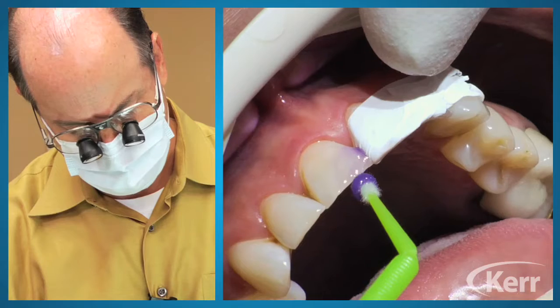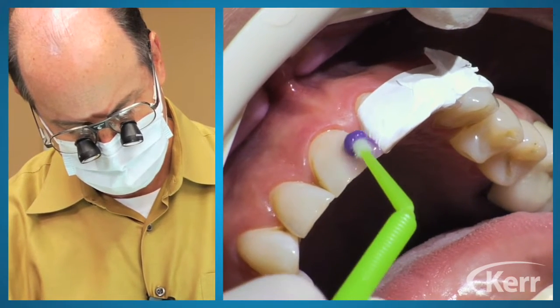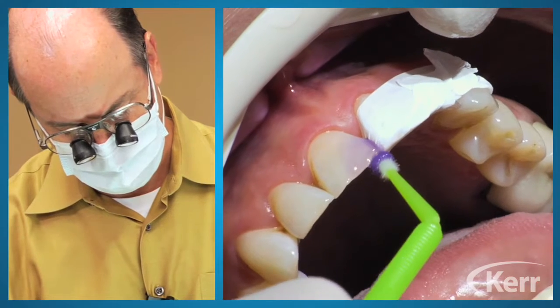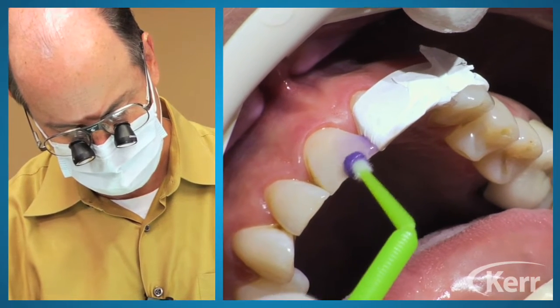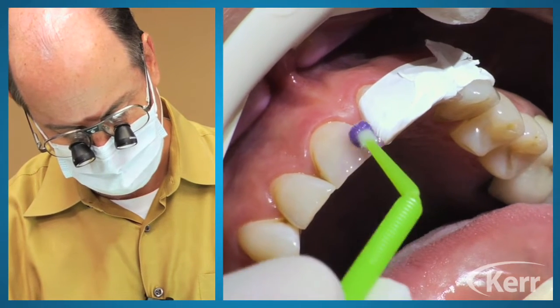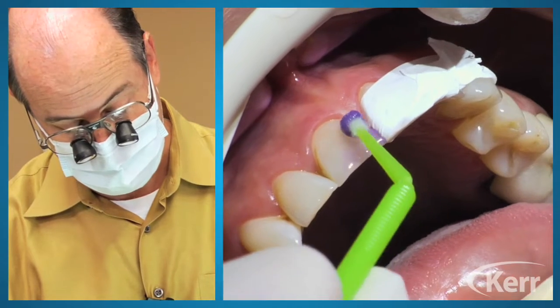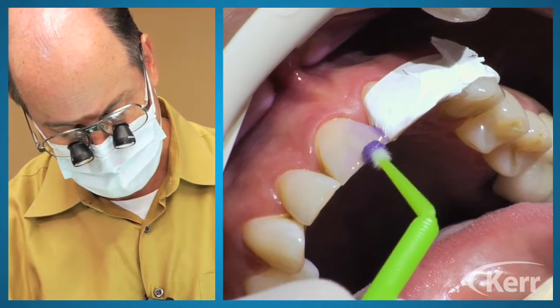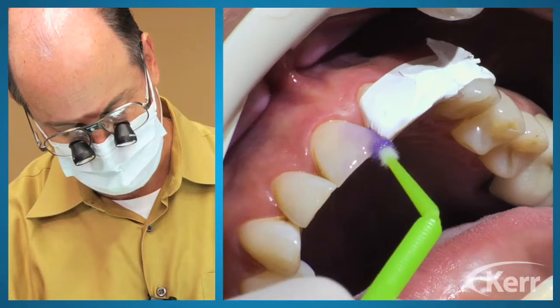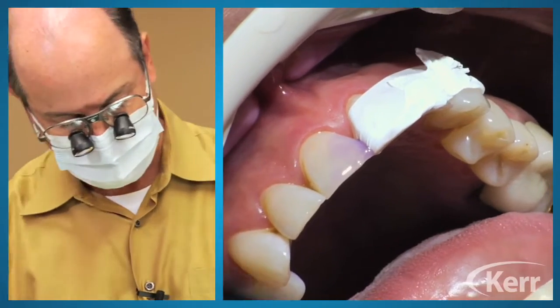This is pretty much all in enamel, maybe a tiny bit of dentin. So we're just using 33, 35, 37% phosphoric acid etch. Dentin we'd only want to etch for 15 seconds. So dentin only 15 seconds. Enamel you can go a little longer if you're all in enamel, for maybe 30 seconds is very safe. So just a nice etch.